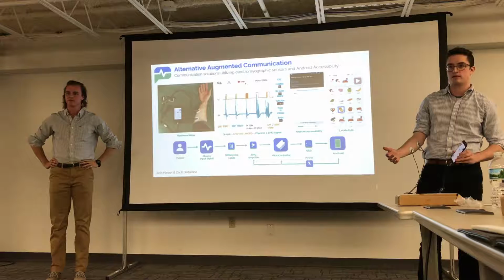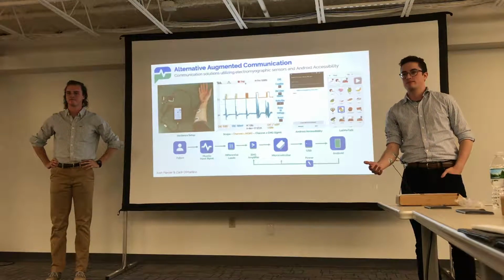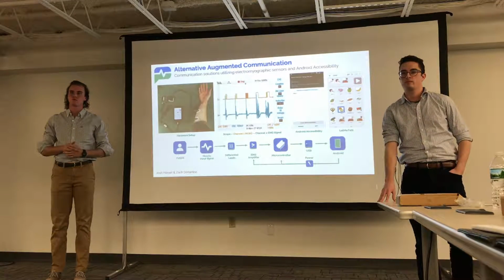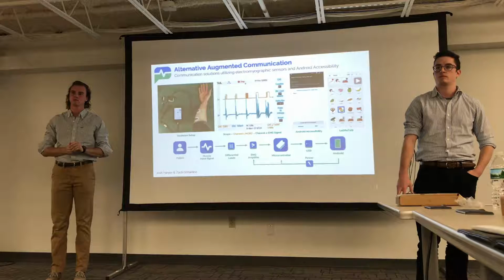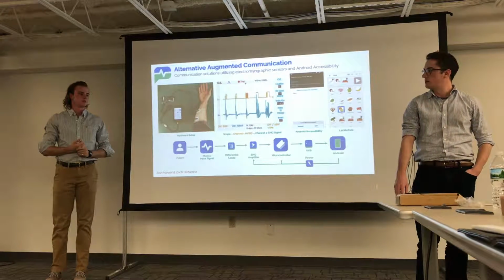All right, I'm very impressed. Within 2 months, you'll be able to actually get this thing working. Now, the Android part basically is the existing app, right? Yep. So when you build the EMG interface with it, can you claim novelty for this? Is any similar product out there, or do you think it's novel?